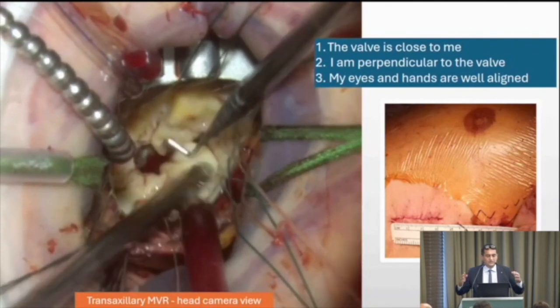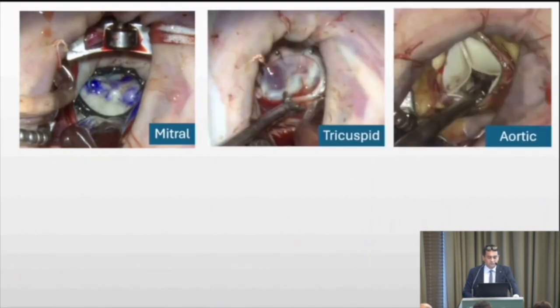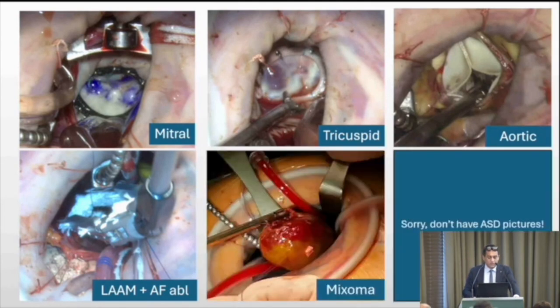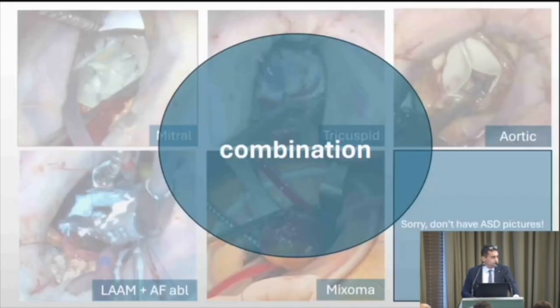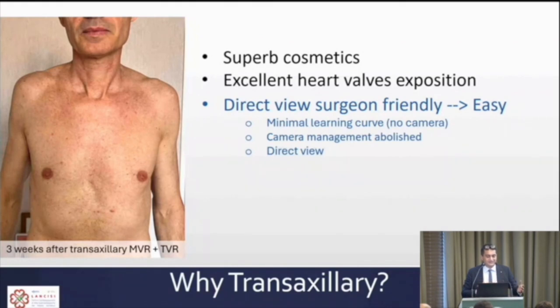After placing your annular sutures, you are in front of the valve — perpendicular, close to it, with perfect ergonomics. This is true for the mitral, for the tricuspid, and for the aortic valve. Entering the chest in front of the right superior pulmonary vein puts you right in front of the transverse sinus, making it easy to manage the left appendage, perform myxoma surgery, ASD surgery, or combine them all.